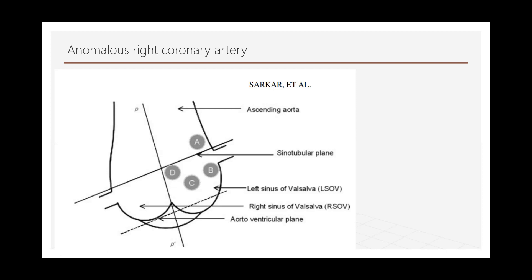Is this an LAO view? It looks like AP view, but you should do it in LAO view when you're doing this engagement.